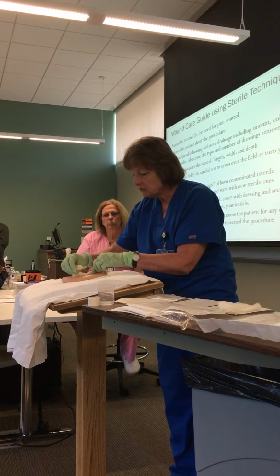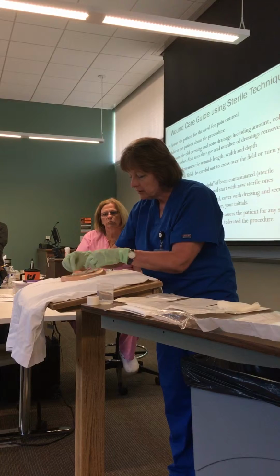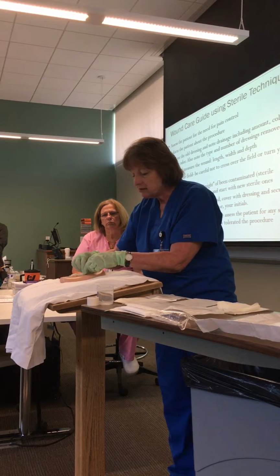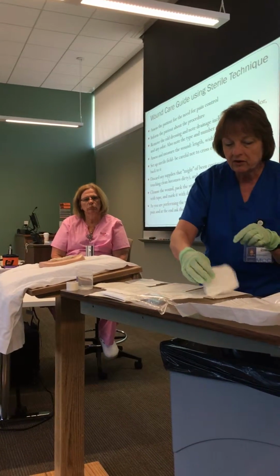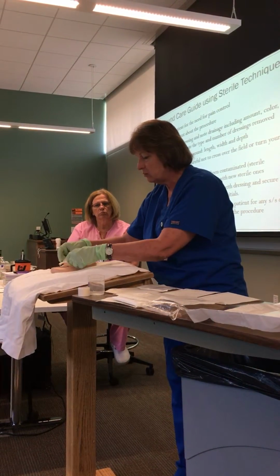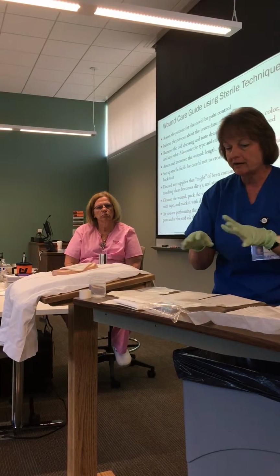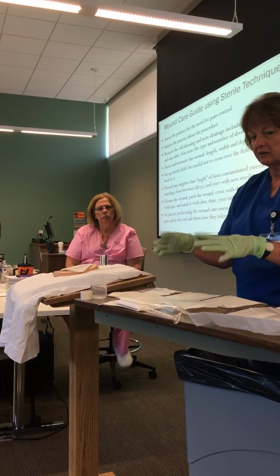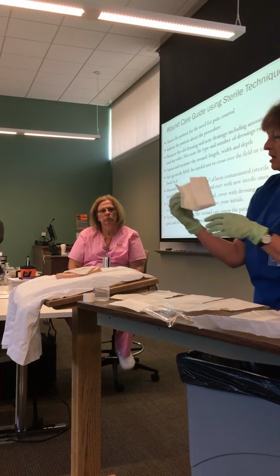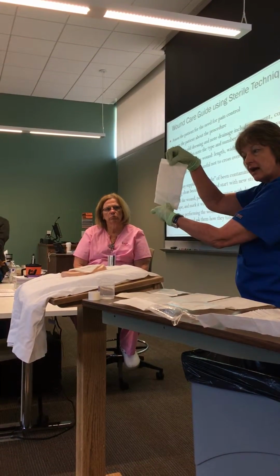All right. And we want to pack so that you have all the nice pink moist granulation tissue covered and not a lot hanging over the edges. So I have one gauze left, so I'm going to just cover that, and you can cover it any way you want. This covers the whole angle there. And then now I can cross over this area, you guys, because I've already got everything gone. So this is Surgi pad or ABD pad, and you want the blue side on the outside.